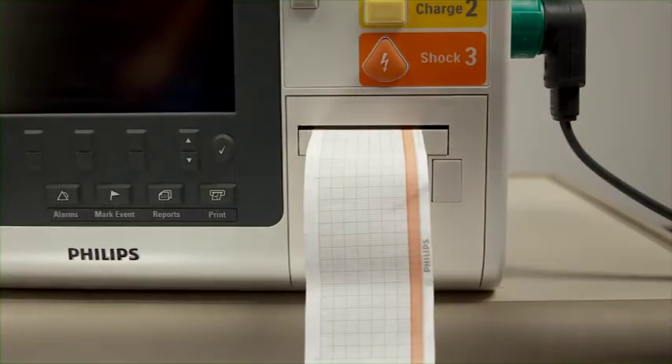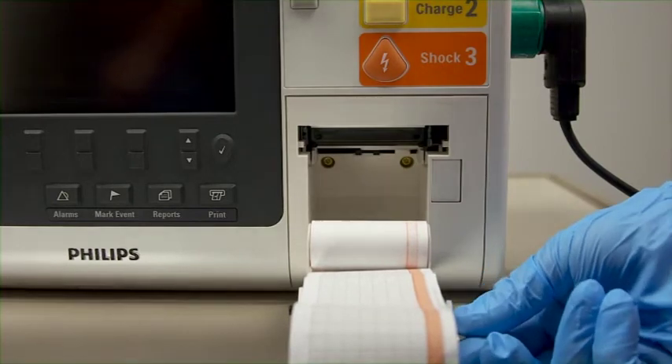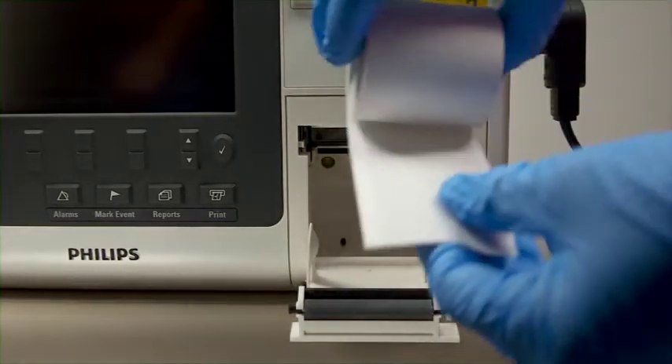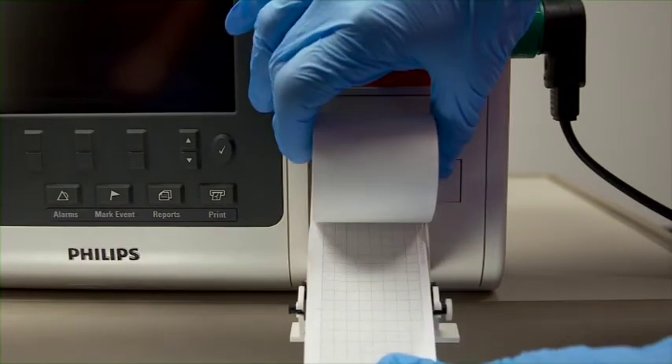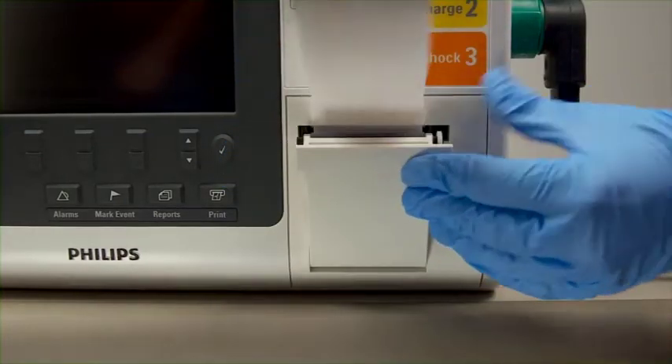To load a new roll of printer paper, open the printer door by pushing on the latch. Remove the empty paper roll by pulling up on it. Place a new roll of printer paper into the paper well, positioning the roll so that the paper is on the bottom and the grid faces up. Pull the end of the paper out past the paper roll and close the printer door.